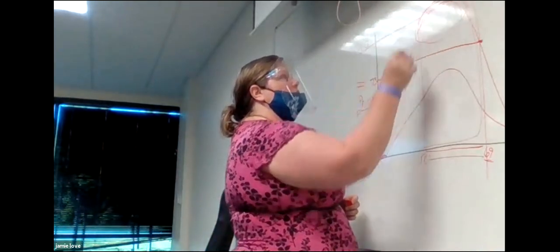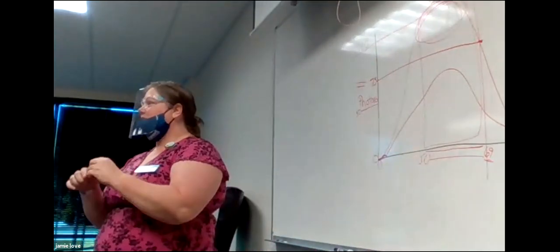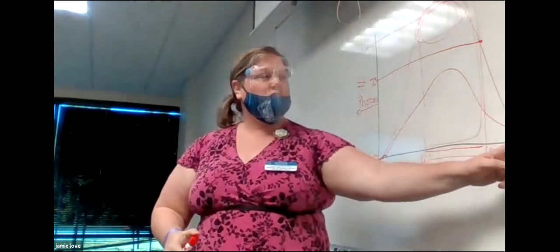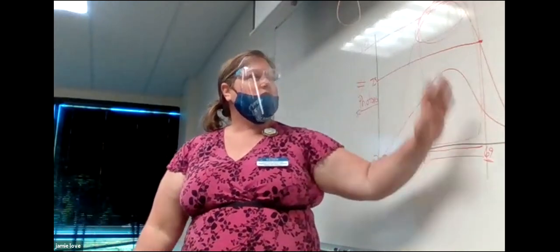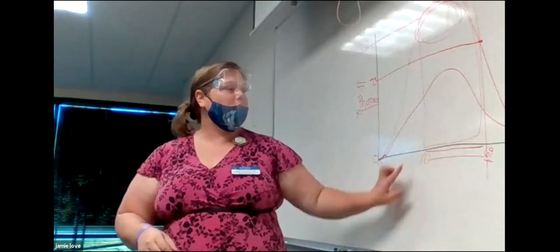So an average of our beam is one third of the kVp set. So if they set almost 100 or 90, our average should have been about 75 or 25, sorry. So maybe my number's off here.